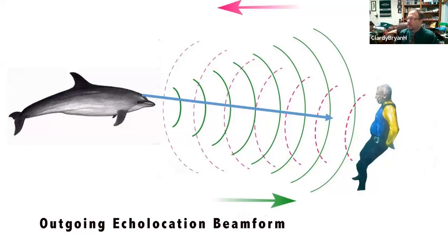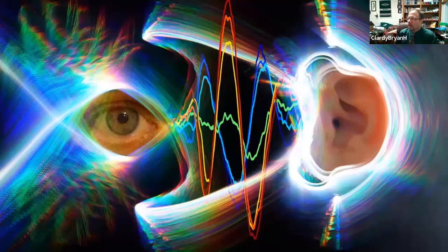Next slide. And what we're really doing here is we're integrating and letting the computer actually integrate it for us, the sound waves being turned into an image. It's similar to the same software used for CT scan or MRI, where individual bits of data are coming back and being reintegrated into an image that's then interpretable by the operator of the machine. Next slide.